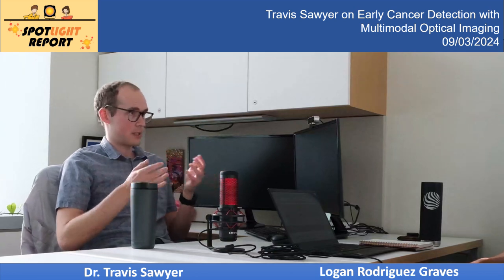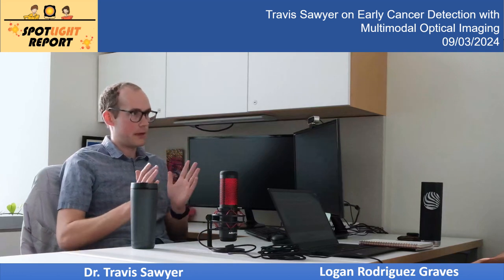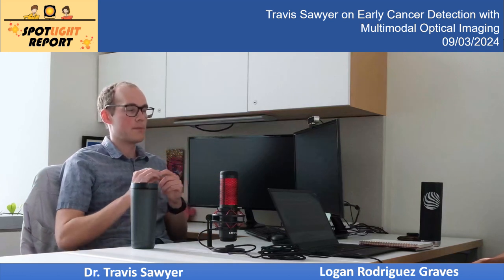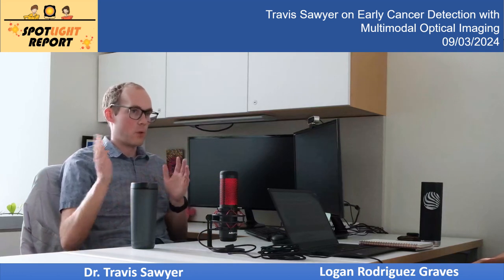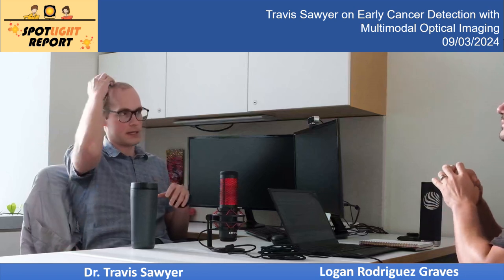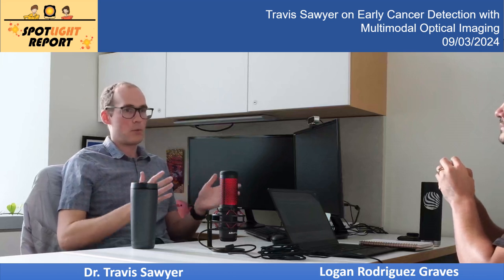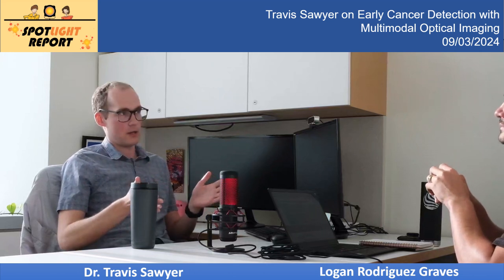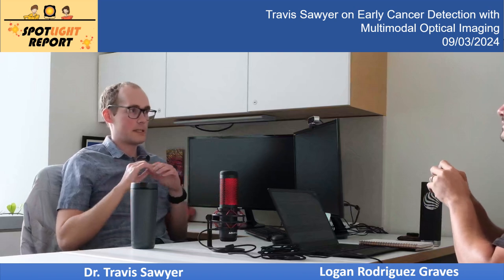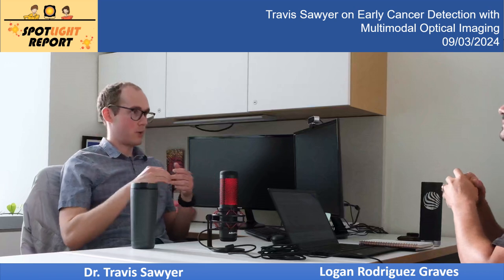One of them is blood, as we talked about. You get a little bit of nice space in the near infrared that lets you penetrate pretty deep before water takes over. And then water absorbs things above a certain wavelength. I don't exactly remember what it is, but with OCT, that operates somewhere on the order of 1,000 to 1,500 nanometers. That also is nice because you don't have quite as much scattering, so you can, again, penetrate more deeply.